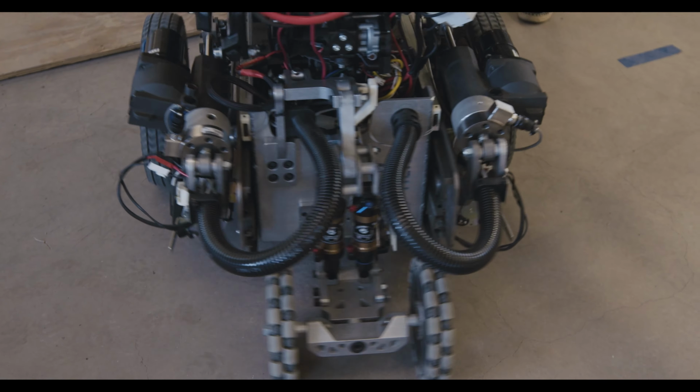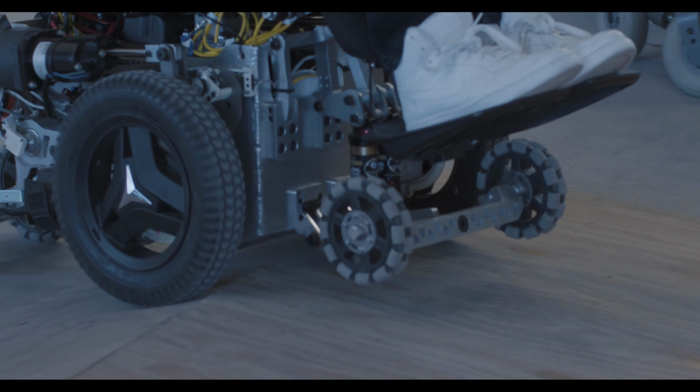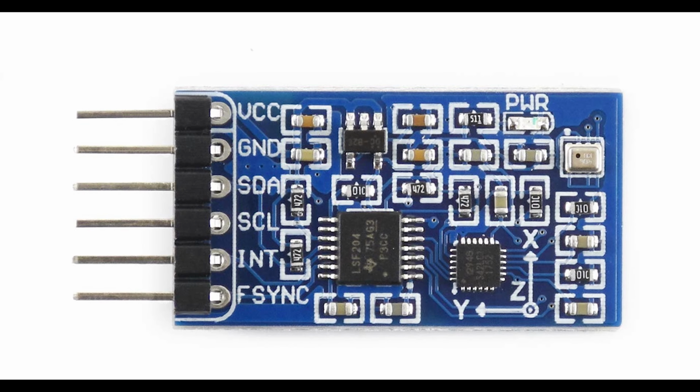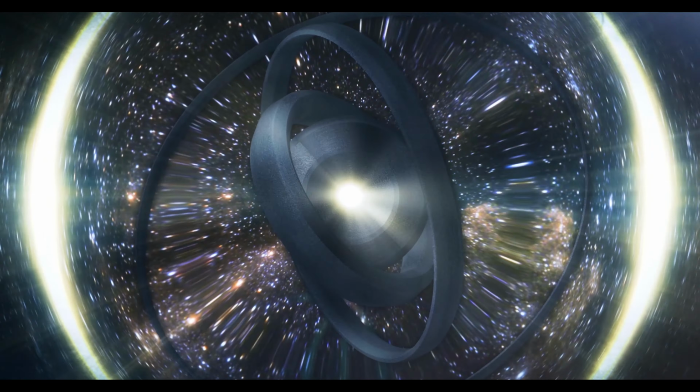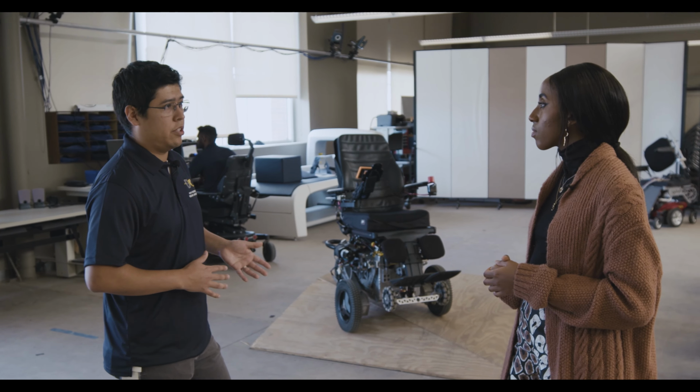We started by interviewing users, people with disabilities, about what kind of needs they had. One of them was safety and mobility in terrains. The idea of MeBot is that the chair automatically levels the seat so it feels safer in these terrains. Does it do that with a sensor, or is it just the arm? It's a combination of both. It has the arms, but it also has sensors. It's called an IMU, a gyroscope and accelerometers, to detect the orientation of the terrain.